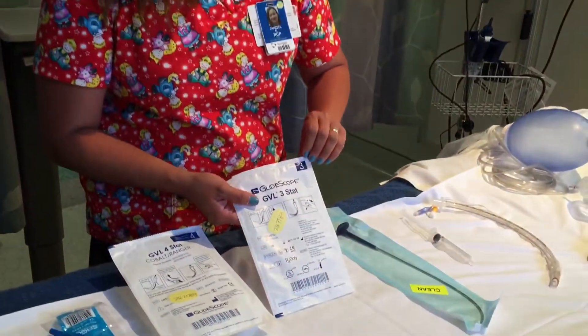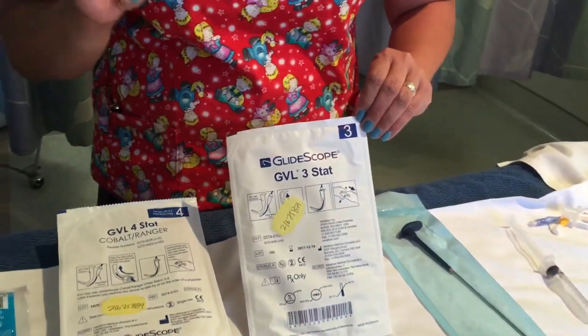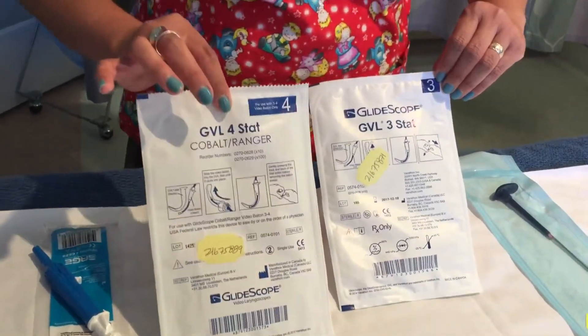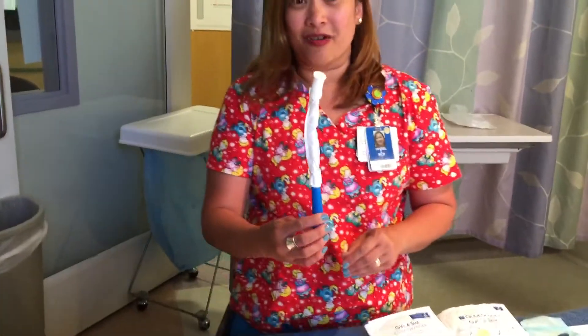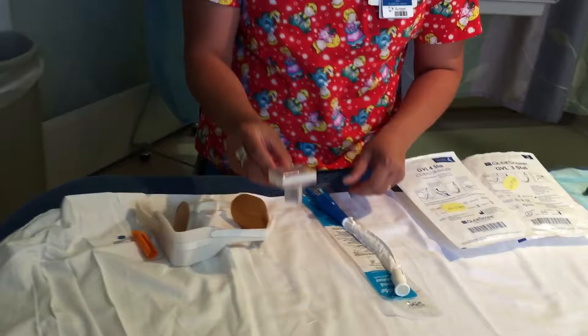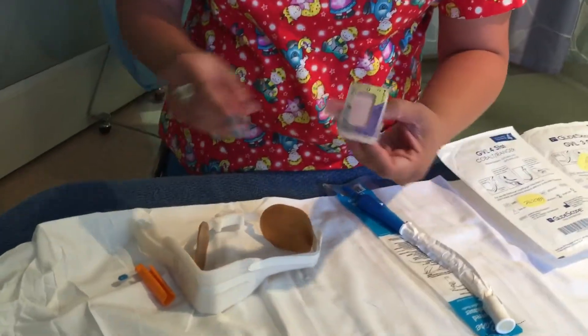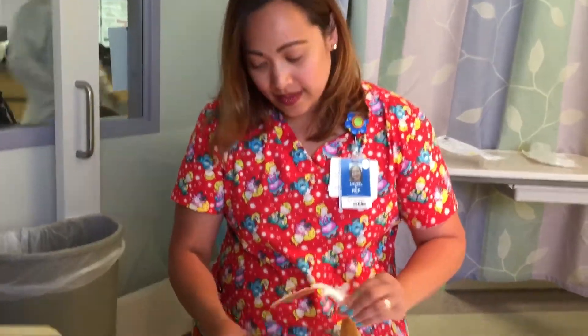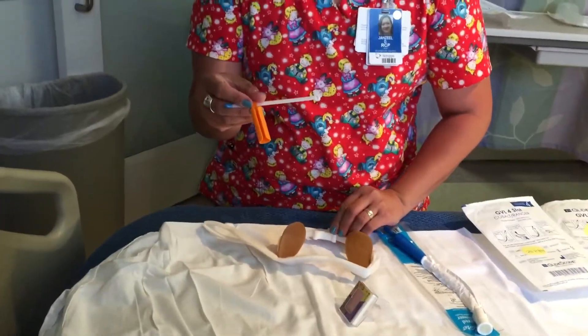For GlideScope adult, we have two sizes for blades: number three for a smaller person and number four for a bigger frame. Next, we're going to be using a Yankauer suction, a CO2 detector to confirm the placement of the tube, and to secure the tube we need to have a Hollister and a bite block if needed.